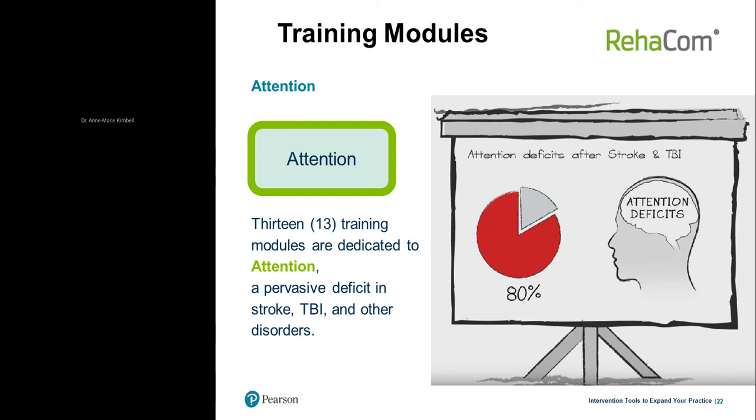So alertness and vigilance and sustained attention, processing speed, focused attention, selective attention, divided attention, alternating attention, visual spatial attention. The therapy modules fully reflect all of those dimensions, and it's important to provide repeated stimulation and activation of the foundational underlying attention dimensions, especially at first. And as soon as a patient has mastered a foundational underlying process at a basic level, then a therapy module at a higher level skill can be chosen to help them.